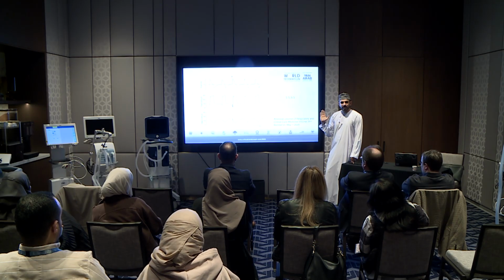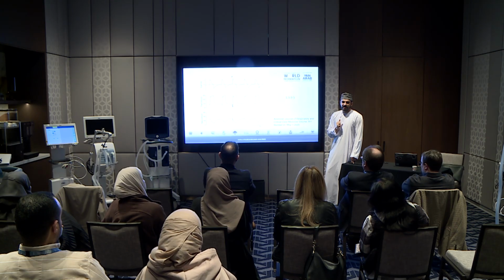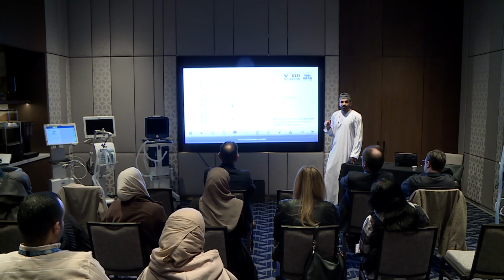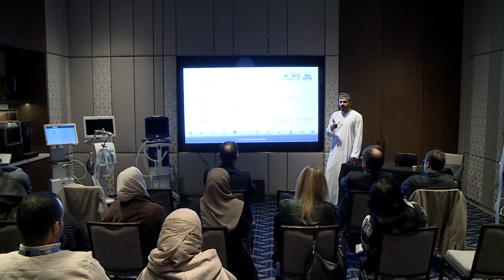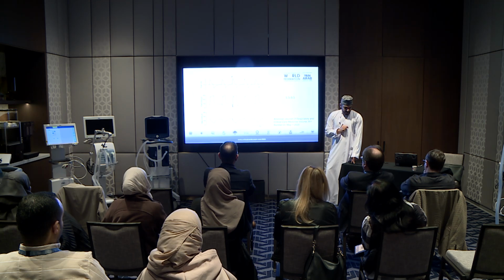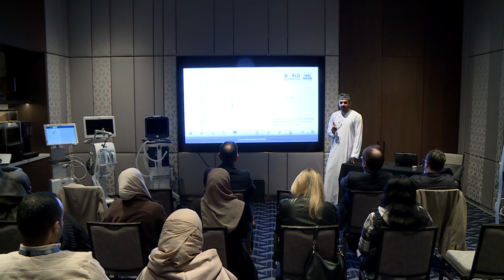We use the occlusion pressure routinely in the ICU, as monitoring every 4 hours, etc. Before COVID, I didn't use it, but after I saw what happened in COVID, we made it a routine in our ICU to measure it every 4 hours, especially at the time when we stop the sedation or stop the paralysis. So does measuring the occlusion pressure actually matter or not?